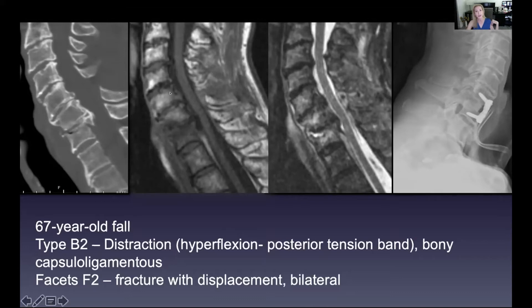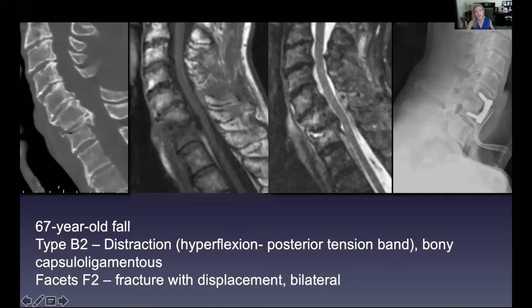On T1, the vertebral bodies should be bright — they'll be dark if there's edema or tumor, and dark here confirms an acute injury. We can also see bright signal in front of the spinal cord on T1; CSF should not be bright, it should be dark. That bright signal is blood, meaning there is hemorrhage, which can expand and further compress the cord in addition to the fracture.